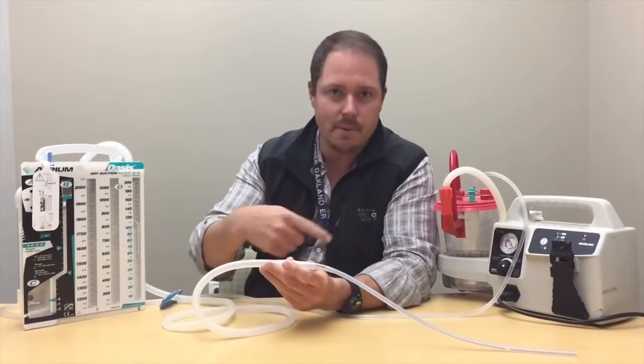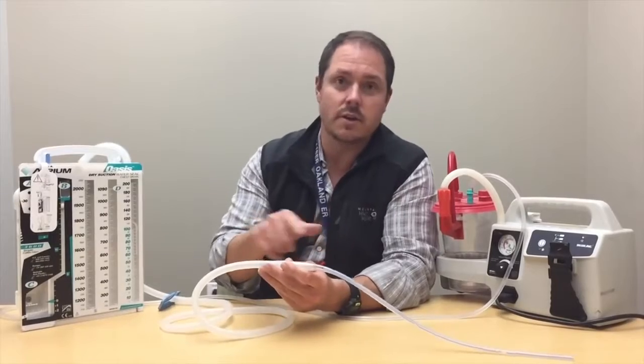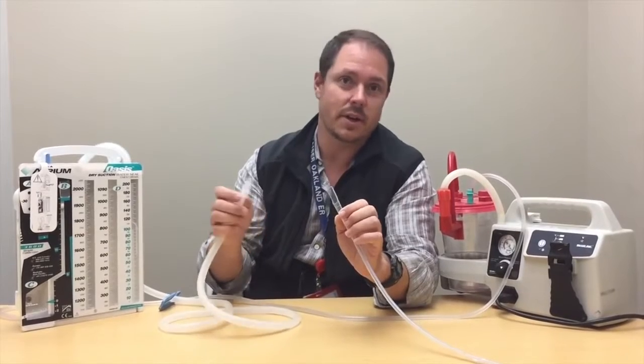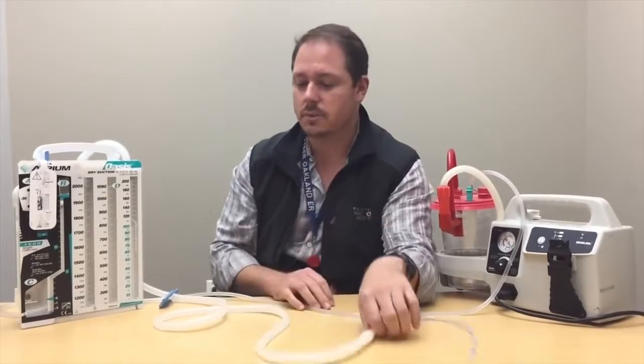Tape it this way, tape it that way, tape it a million times. We used to use foam tape — we did anything we could so that these two don't separate. This separating is catastrophic if you don't catch it immediately, as it leads right to tension pneumothorax. So be very, very liberal on taping for the chest tube.